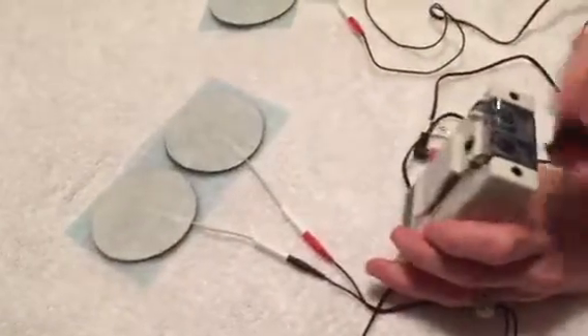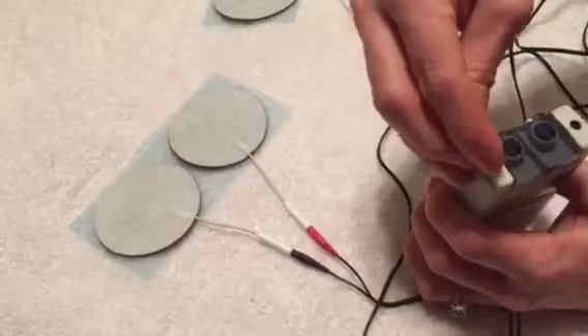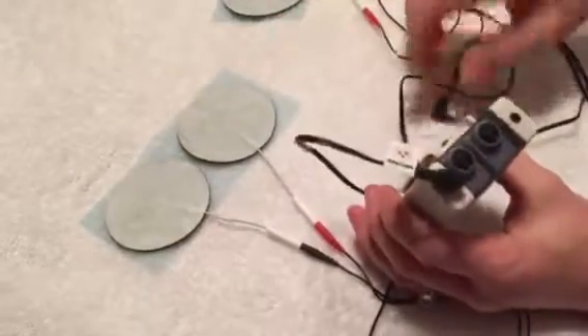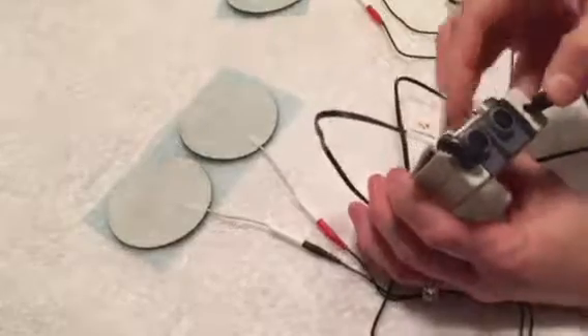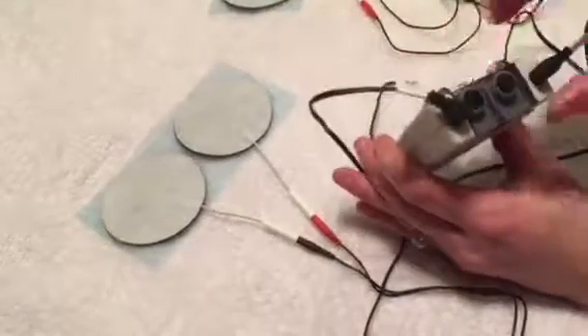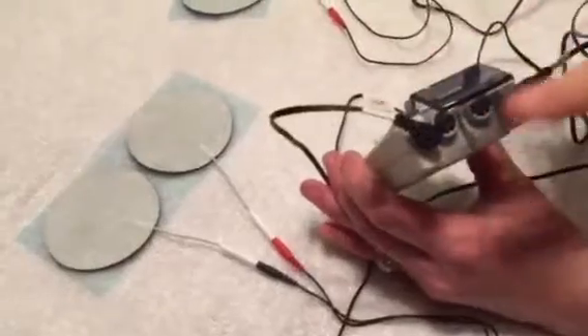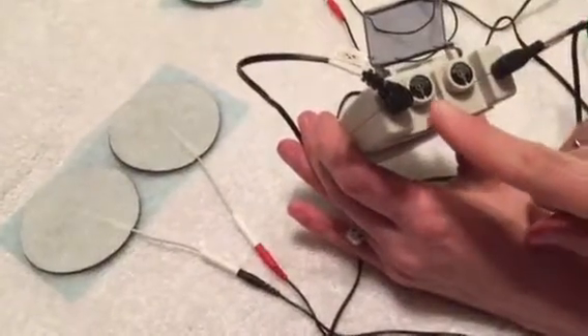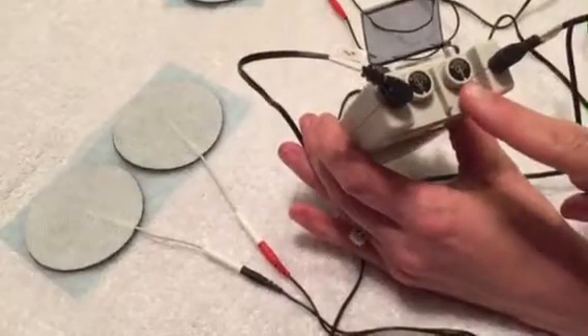Then you're going to plug the wires into the TENS unit into each one of these plugs here. We call this channel one and channel two that they're plugged into. You can tell that by removing this hard plastic cover, and you'll see that there is a one and a two.